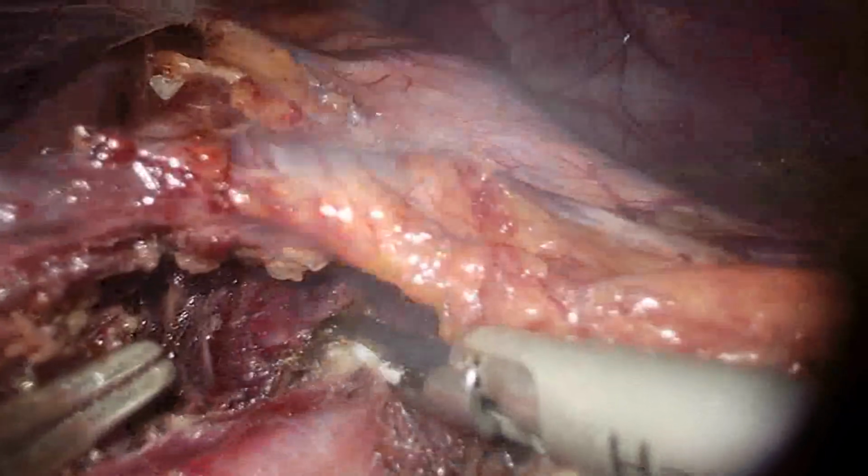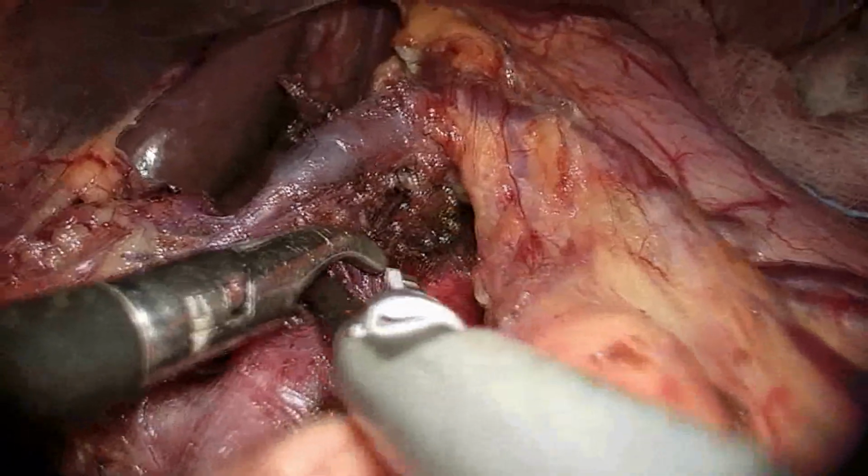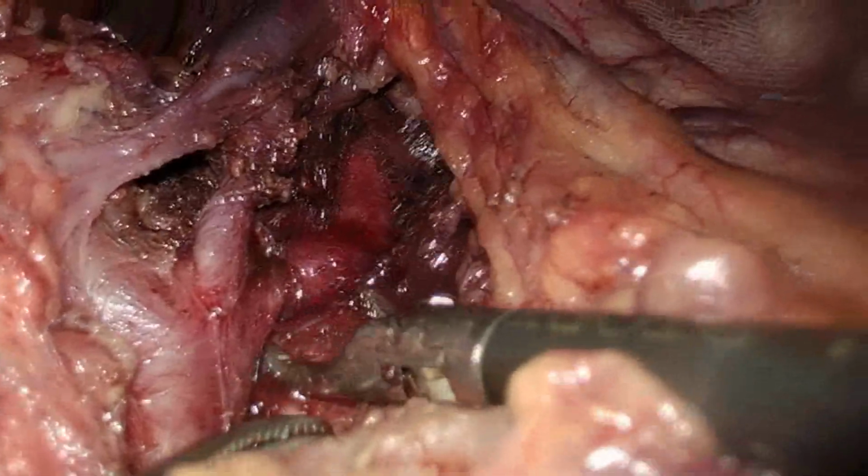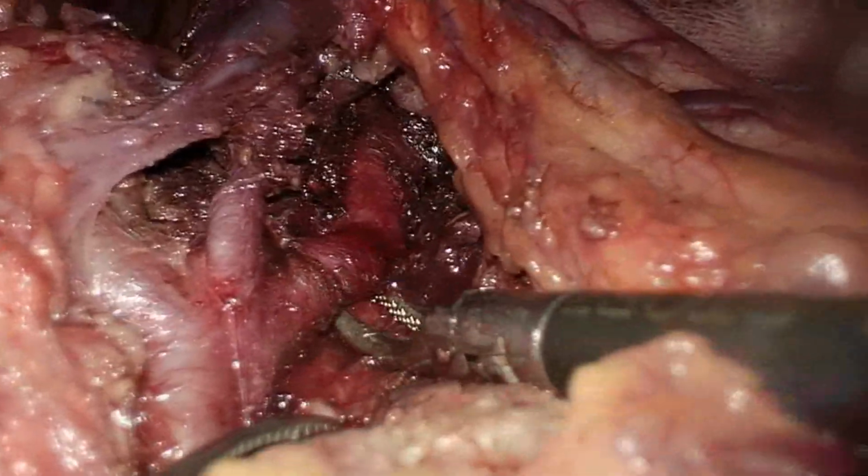It should be incised completely. The whole vessel should be made bare, and then all the neural tissue adjacent to the vessels is excised. So the trifurcation is seen properly.